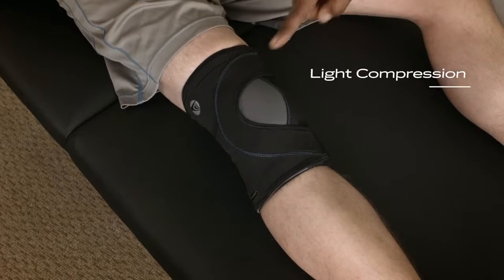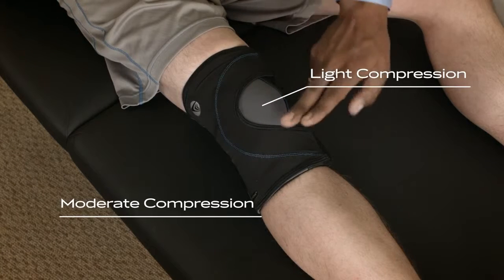You'll notice the brace has two colored fabrics: a gray fabric and a black fabric. The gray fabric offers light compression. Make sure that it is over the kneecap and around the back of the knee.